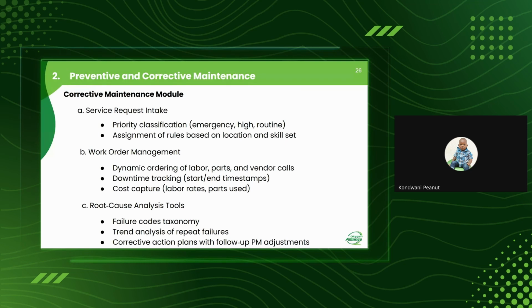All right, let me come in. That's a very good question. In most of the cases, especially in Malawi, I don't know, maybe other countries it may be like that, but we have a tendency whereby these small portable devices are omitted. They are not taken as devices as such.